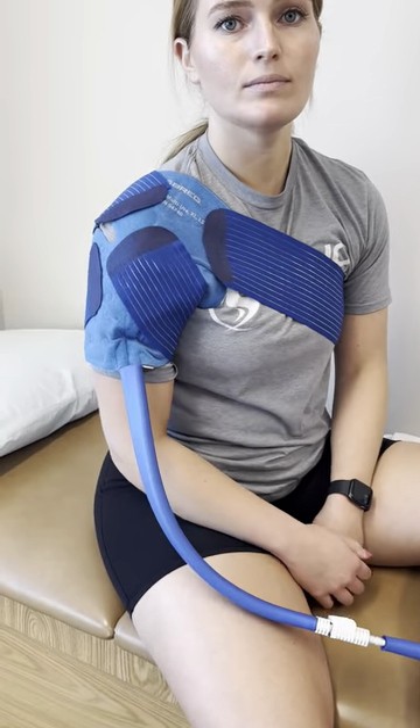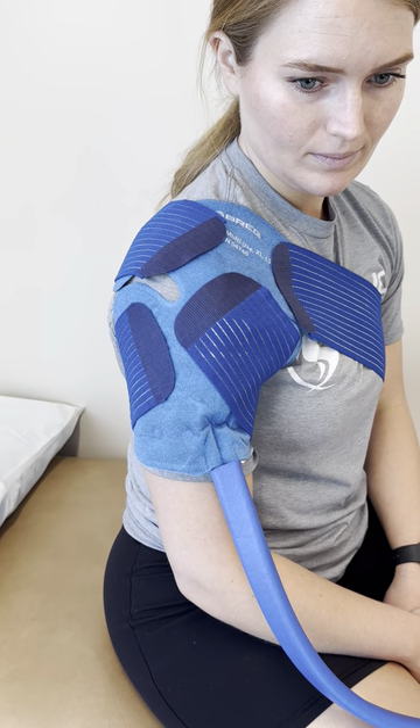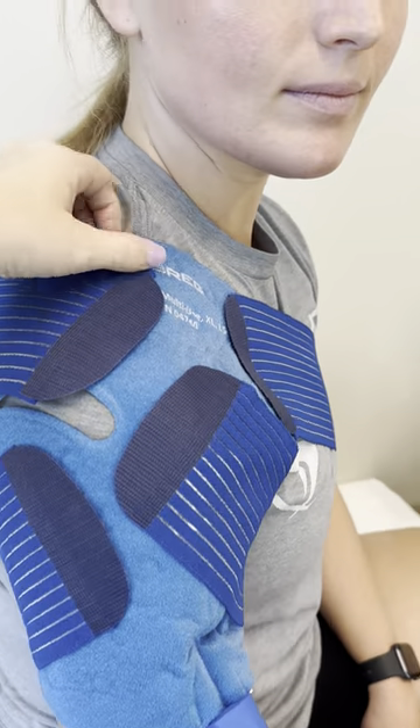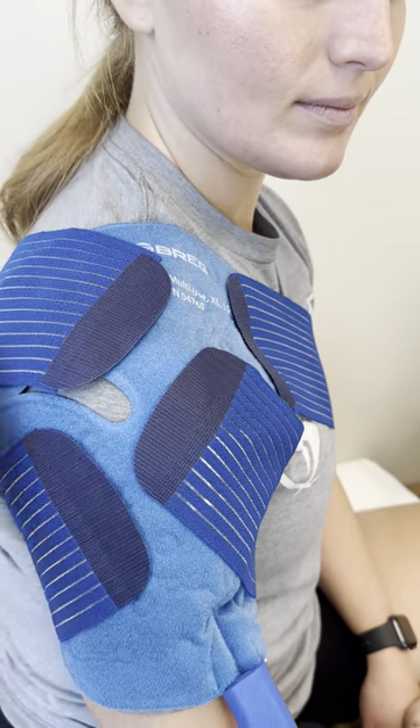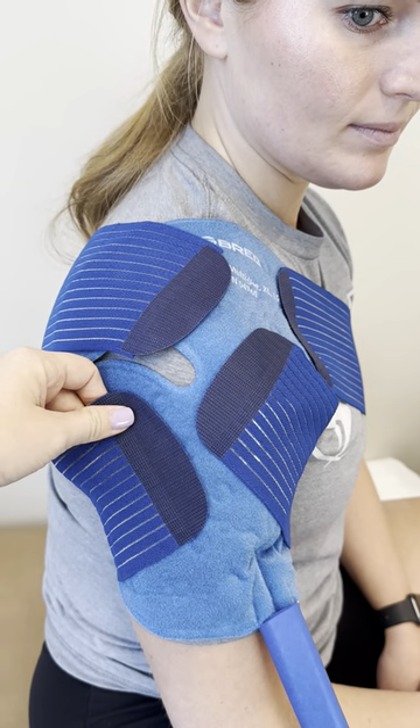We typically fit the ice pad to you at the time of surgery, but if you take it home beforehand, this is how you'll set it up. On the shoulder, you'll center the pad here, and then you'll use these two adjustable velcro straps to make sure it's snug to your arm.